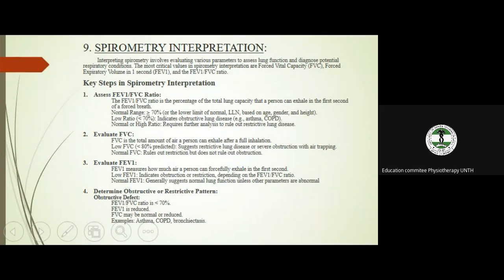That is the good thing about the spirometer. So of the patient, you see all those parameters that you'll be looking into, not only the curve. So you look at the parameters, look at the curve, the flow-time curve, the volume curve, and every other thing.